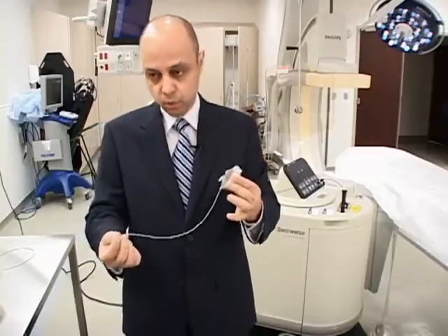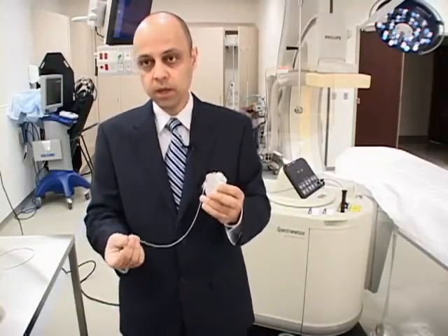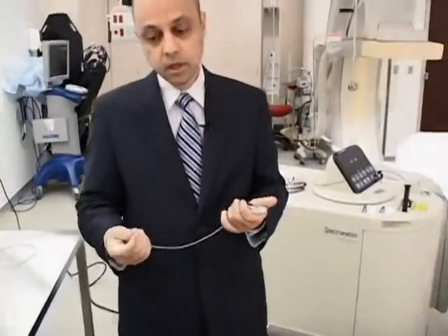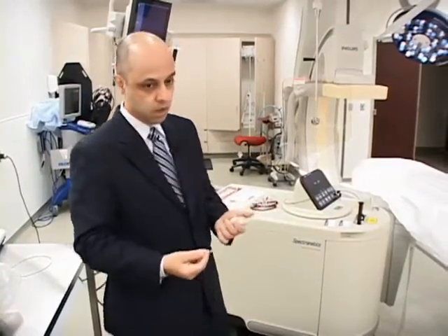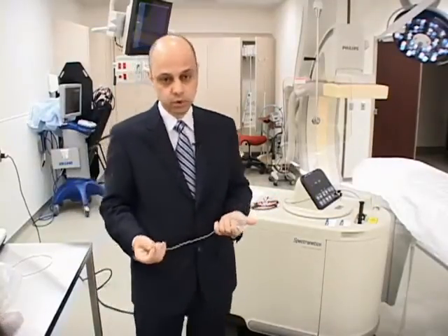As years pass by, the scar tissue becomes more and more, and the attachments are more and more, so it becomes very difficult after a few years just to remove this lead. The latest technology to remove the lead is basically the laser removal system that we are fortunate to have here.